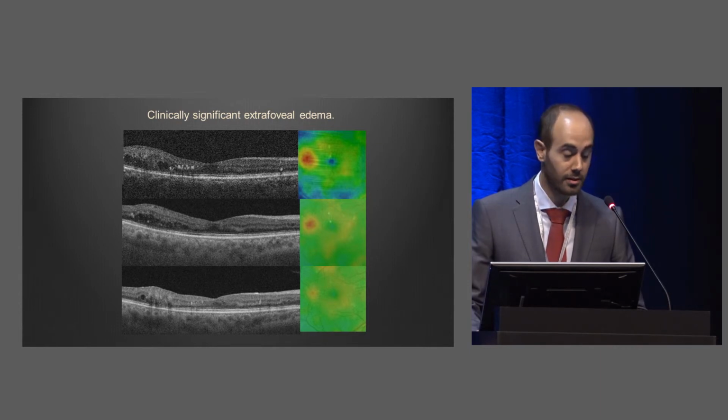First, maybe the less controversial, the clinical significance of extrafoveal edema. Still today, many practitioners will treat this with conventional laser, very mild burns, in order to reduce this edema, which is slowly creeping, sending exudation towards the fovea. This will be within SubLiminal. In diabetes, you always have a slower response, but it's usually more durable.